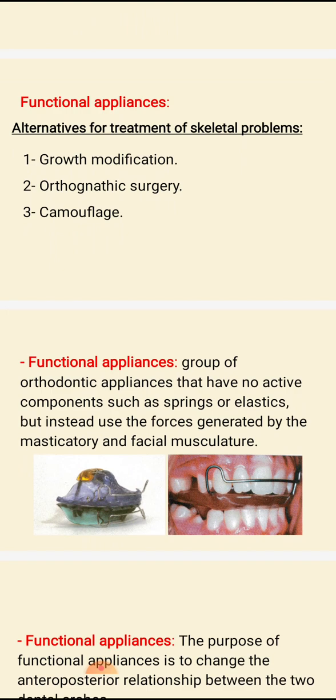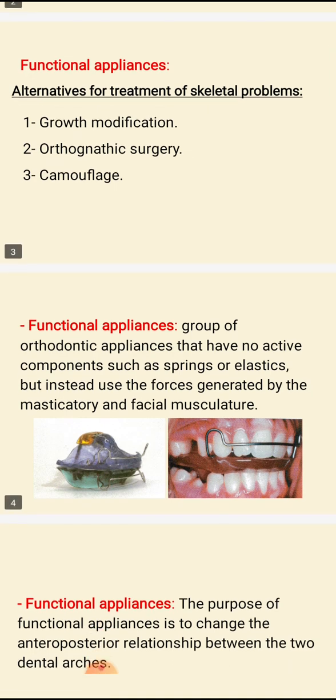Functional appliances are a group of orthodontic appliances that have no active components, such as springs, elastics, or screws. Instead, they use the forces generated by the masticatory and the facial musculature. They use these forces to change the skeletal relationship between the upper and the lower jaw.